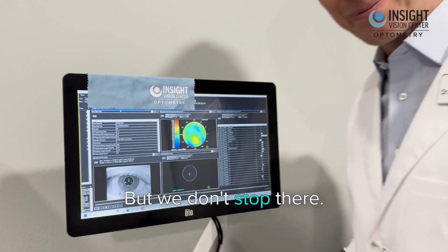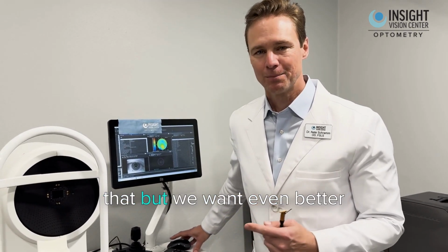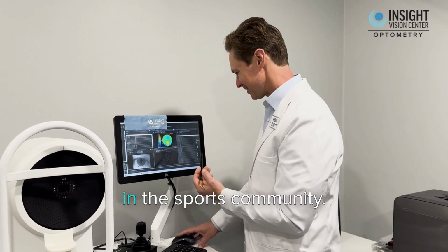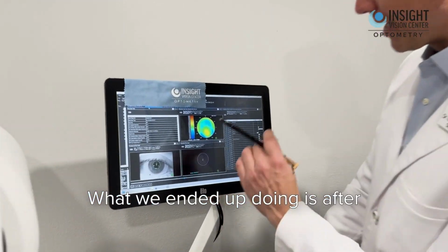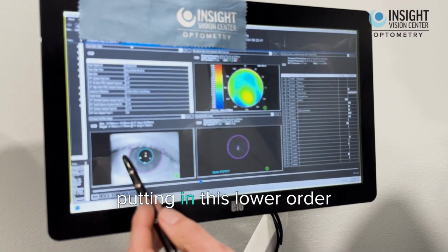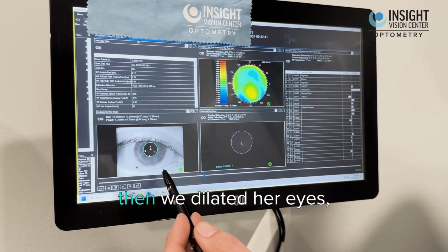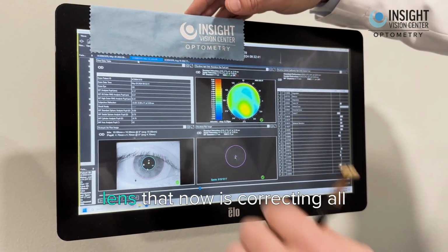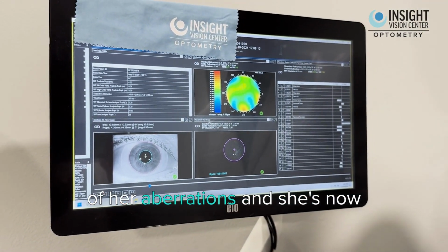But we don't stop there. Most patients will be happy and most docs will be happy with that. But we want even better vision, better, faster, stronger, as they say in the sports community. So come on back in. What we ended up doing is after putting in this lower order aberration correcting lens, the first impression lens, then we dilated her eyes, did another scan, and ordered a lens that now is correcting all of her aberrations.